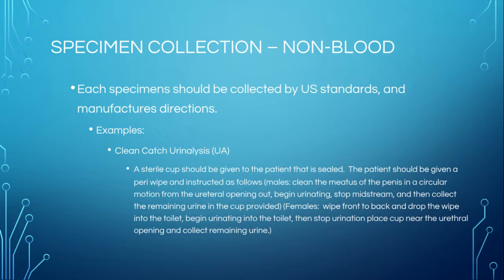You're going to have a pair of gloves, and you're going to have a biohazard bag. And the biohazard bag, you want the patient to go ahead and put the urine specimen in the biohazard bag. The gloves are for you so that you don't get urine on your hand. You want to tell the patient when they go into the bathroom to wash their hands. First thing they need to do is wash their hands.